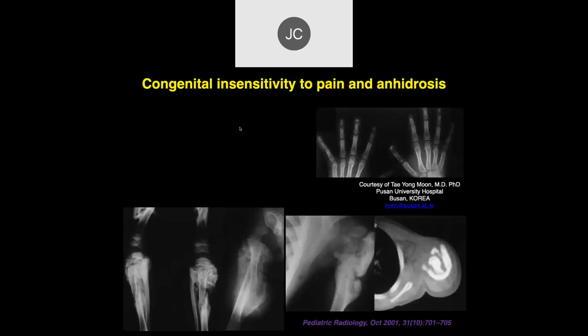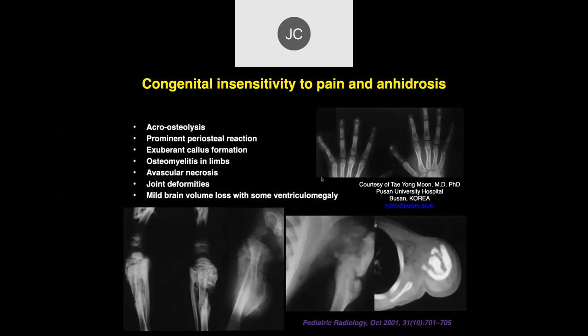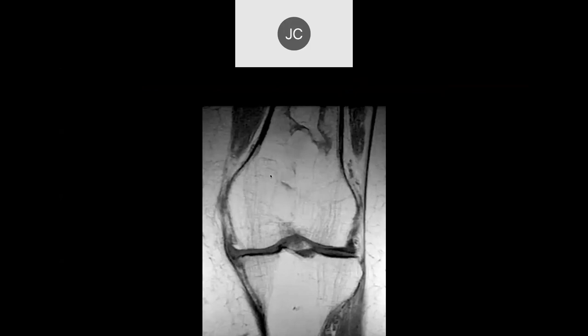Other examples of this same phenomenon show clubbing and resorption of the distal phalanges, also typical in this condition. The findings include acro-osteolysis, prominent periosteal reaction, exuberant callus formation, and superimposed infections, leading to joint deformities.